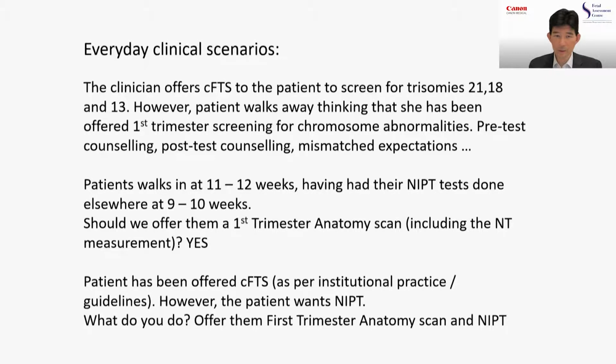Second scenario happens all the time. A patient walks into your clinic at 11 to 12 weeks of pregnancy, and they wave the NIPT test result in front of you and say, hey, look, I've had it done elsewhere at 9 to 10 weeks, and what should I be doing next? So as a clinician, the question you have to ask yourself is, should you be offering them a first trimester anatomy scan? And the very short answer to that is yes.